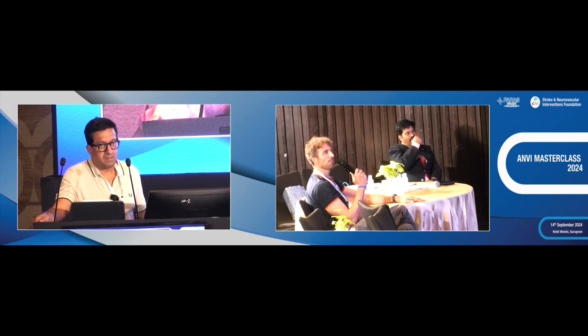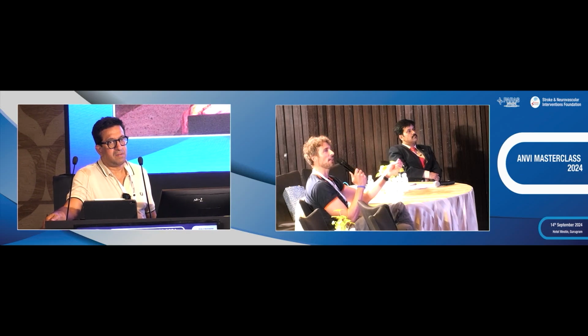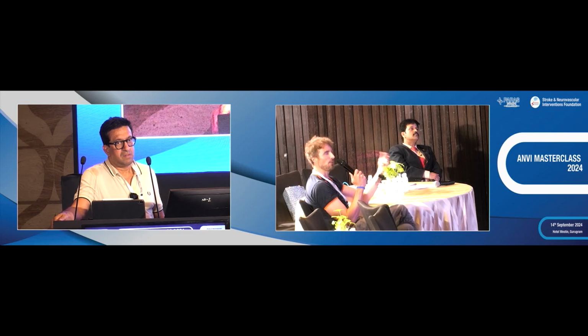a key point. And the flowchart provided by the manufacturer, in my view, cannot cover the complexity of the shape of the aneurysms. Even if you take AP view, lateral view, you are missing the complexity of the shape. So it's a good approach to embed. But Tufail is sizing well because he has 15 years of experience in the field and so he finds a good size. But if you do not have 15 years of experience, it could be difficult to size well.